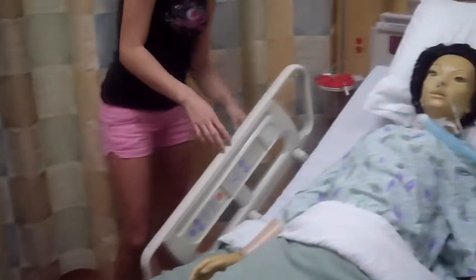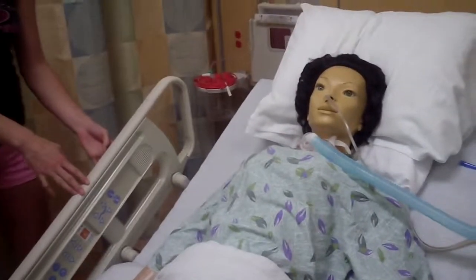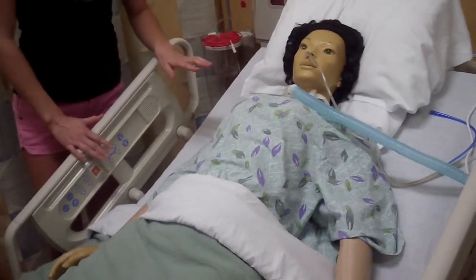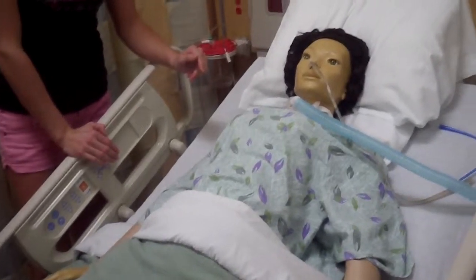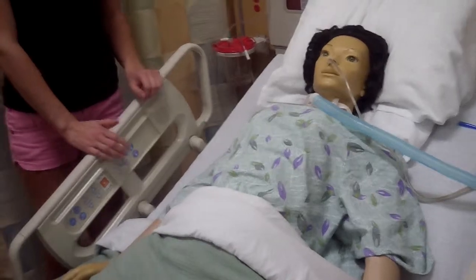Then I'm going to lower Miss Jones back into a comfortable position. And I'm also going to reassess her for respiratory rate, effort, pulse ox, and general lung sounds. And that's it.